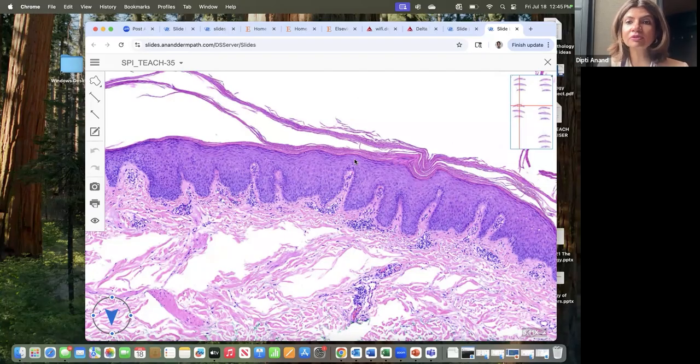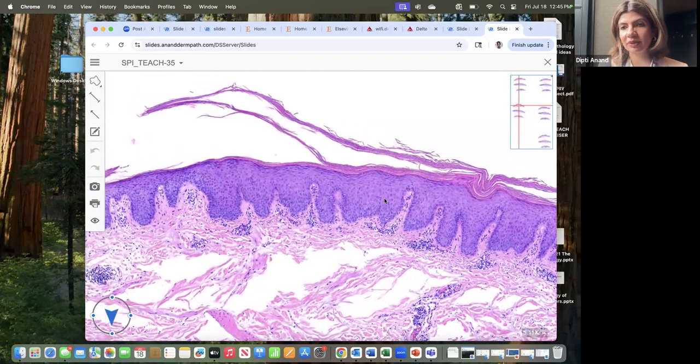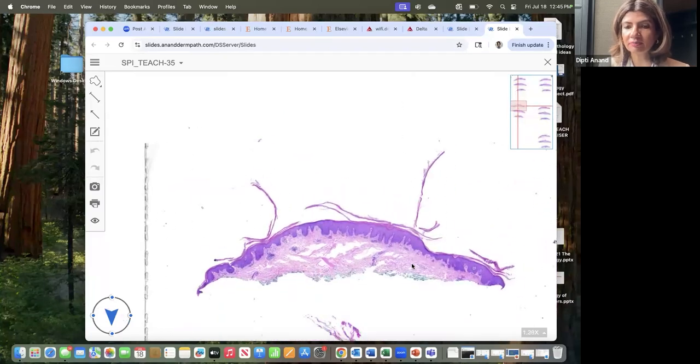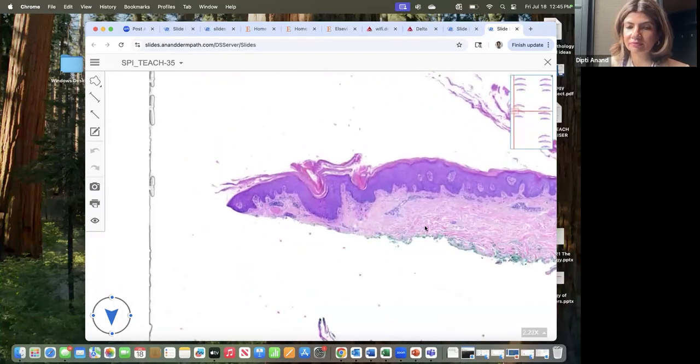So I'm giving you multiple clues here. There is a psoriasiform pattern. Psoriasiform is not that prominent. You have bulbous, more rounded rete ridges, and you have suprapapillary plates, which are thicker. Okay, and your cornified layer is bright pink. Okay, the other feature in PRP is follicular plugging.